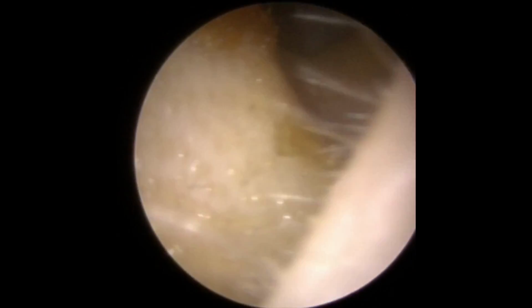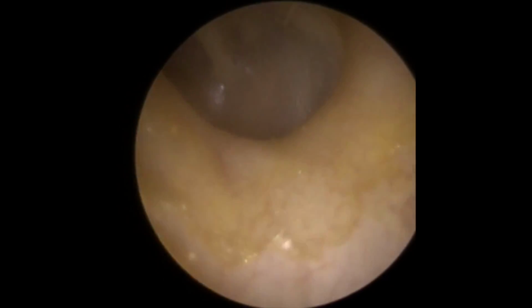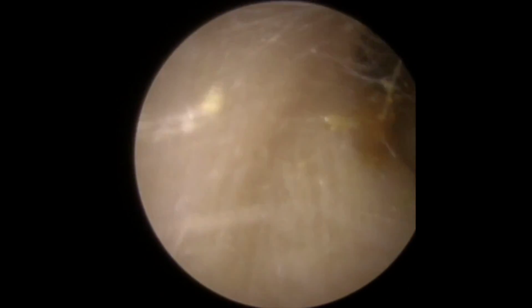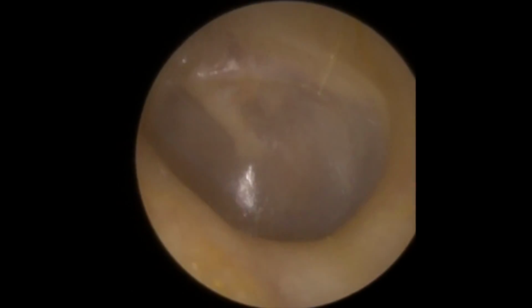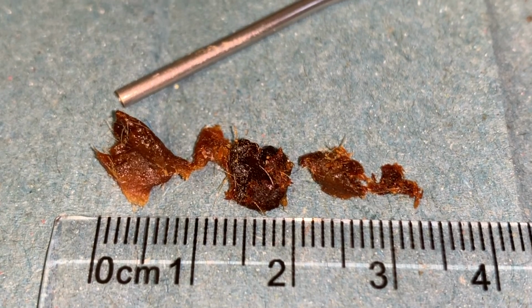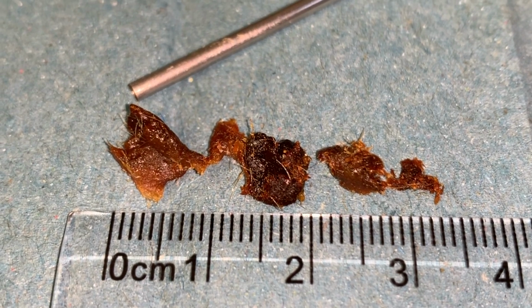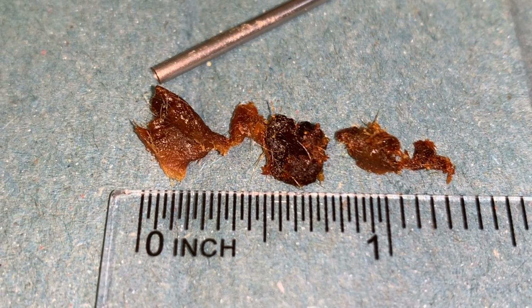So what you can see here is this bigger chunk just starting to come away now. So we're managing to get this out, just pushing the hairs aside. There's the eardrum looking lovely and shiny, all looking nice and healthy. There's that little bit of sticky wax there to the left hand side, so we'll just get rid of that. There you go. And there we are again, looking good. So this is what we removed. You can see the difference in color, this kind of reddy brown colored wax tends to be stickier, slightly hardened up type.